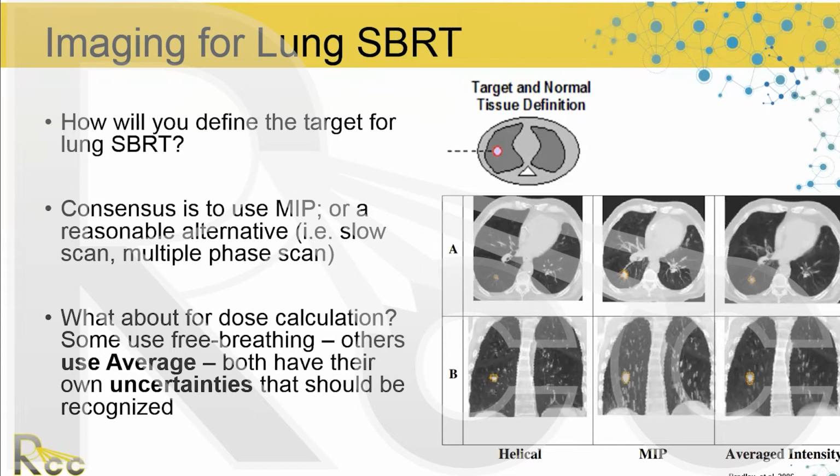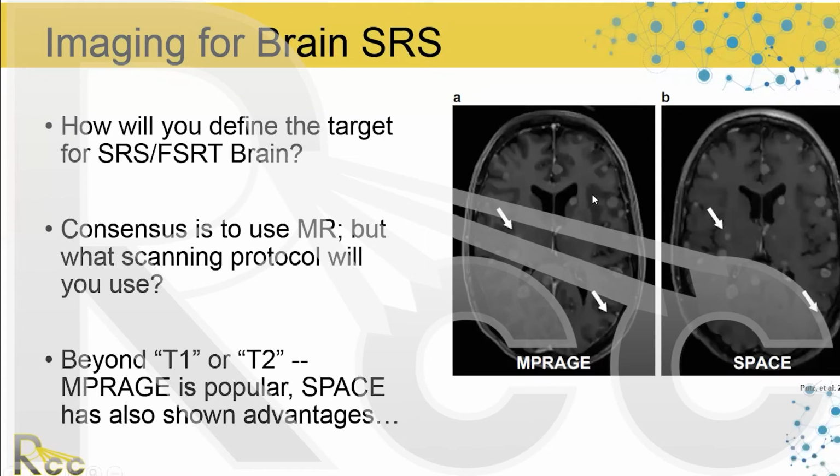Thank you. Another question was regarding the brain. They were asking what MP-RAGE and SPACE are. I'm not an MR physicist. I'm pretty sure MP-RAGE is a T1, but it's a specific pulse sequence. I can't give you that, but this paper right here will give you more details on the image sequence. This is Putz et al., 2020.